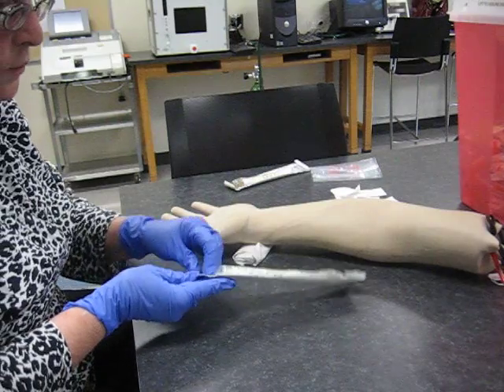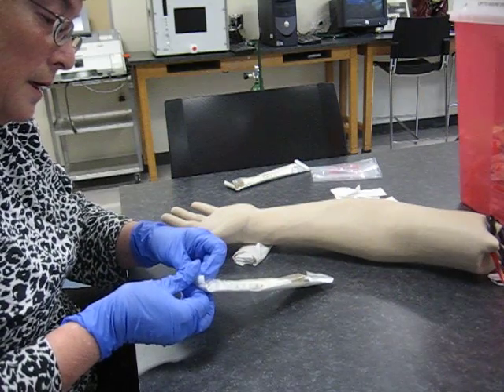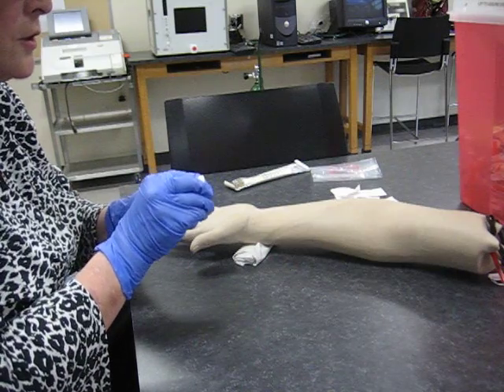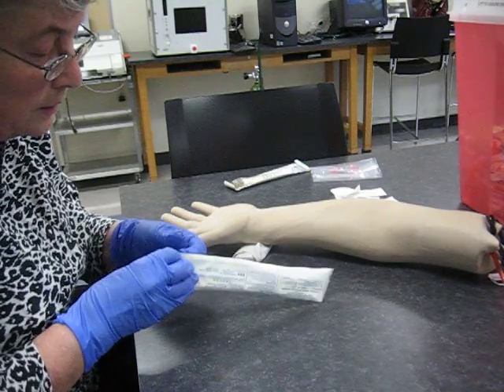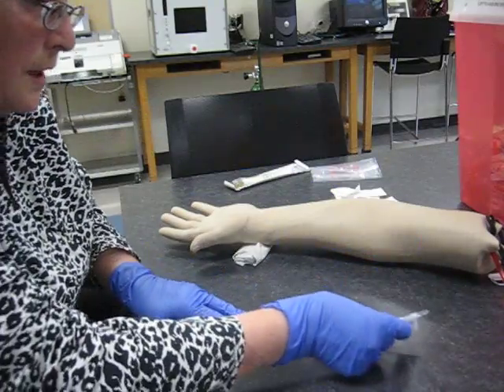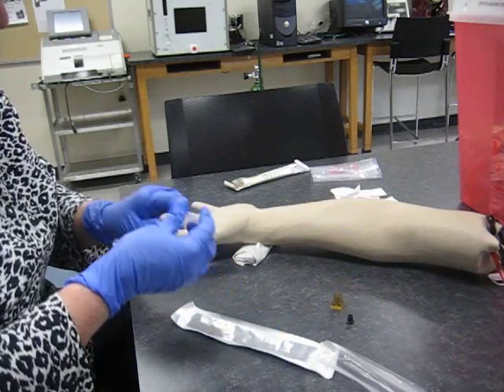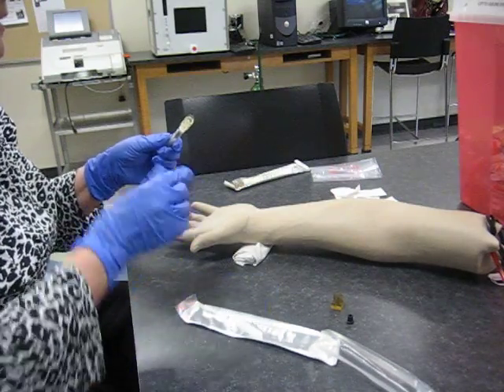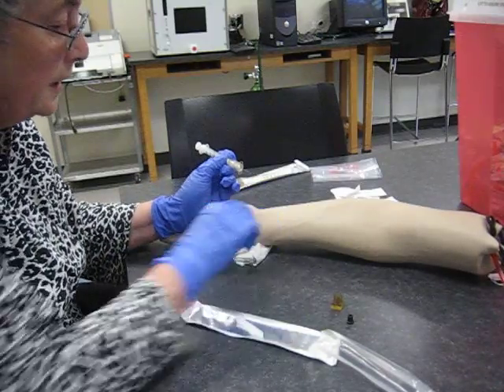Now I prepare the needle. Normally I like to prepare the needle with my back to him at his bedside table — I don't like to use a patient as a table, it's impolite. Besides that, if he does jerk, he's allowed to knock everything off. This is an old-timey kit and it's got a little rubber stopper — I'm going to put the needle in that later. Bevel up, at a 45-degree angle.